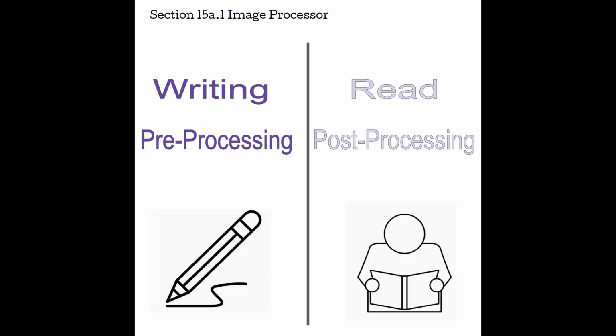But once we hit that freeze button, the memory is no longer accepting new data and is only available for reading. That data that is saved in the memory at this point can undergo post-processing changes, but the trick is that we can always bring those post-processing changes back to exactly where we started from, because that is what is saved in the memory. During the writing process, we can truly never get back to that original data because, again, it's always being written over.